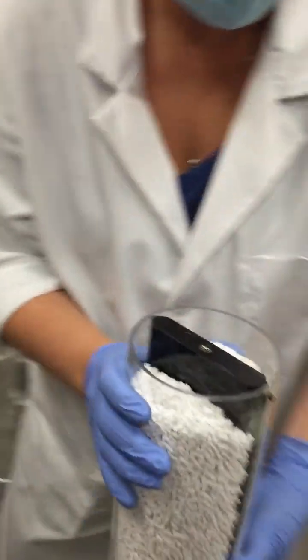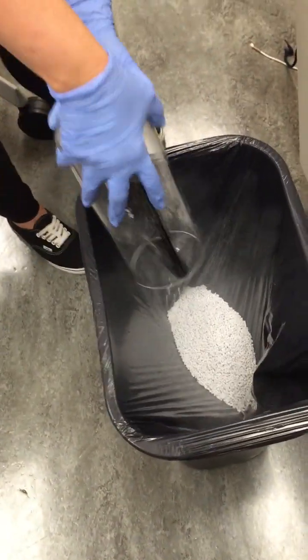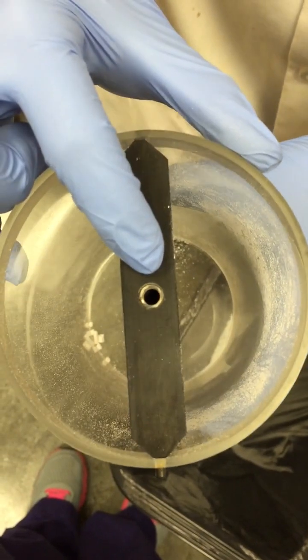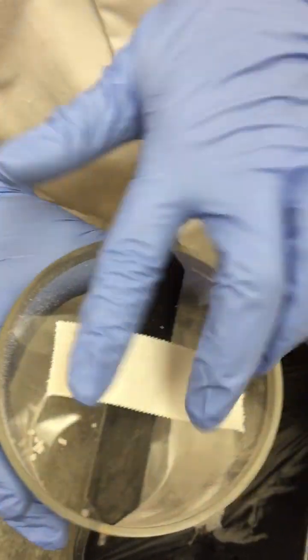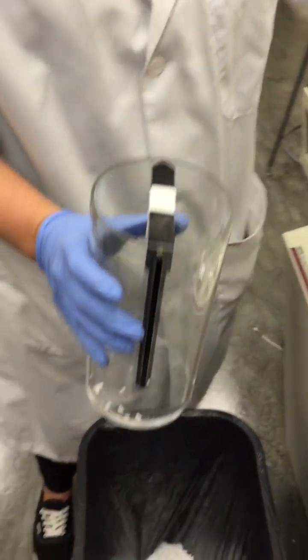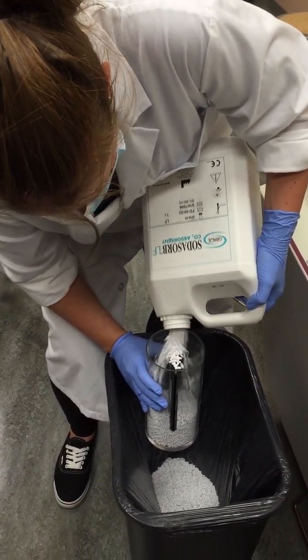Okay. Now I'm going to dump the granules into the garbage bag. See all that dust? That's why we wear our masks. And if you see here, this is the screw hole that attaches the canister to the anesthetic machine. You do not want to get any granules in this hole. So to prevent that from happening, take a piece of tape and cover it up like that. Okay? From there, we'll take our granules, and now we don't have to worry. We can just do this over top of the garbage can, and we can pour our granules into our canister.